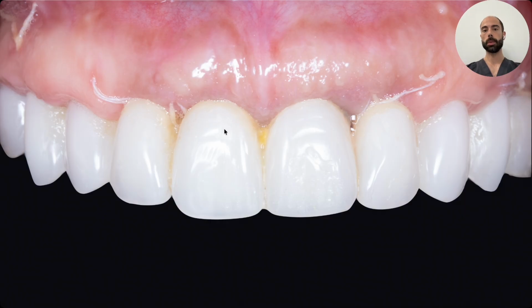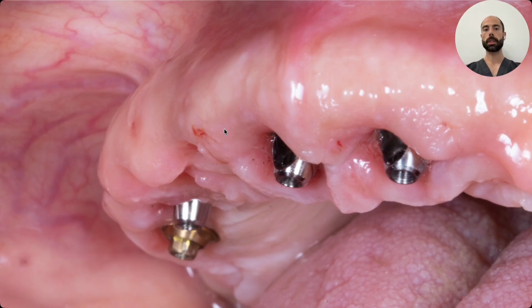And 2 weeks later, this is what we see. Healthy gingiva, perfectly adapted to the provisional, volume exactly where we planned it. Look at that volume that we've added with the full-arch CTG. Every interproximal space has tissue, every site we grafted has responded. And this is the window that matters. The provisional is now the scaffold for soft tissue maturation. Over the next 3 to 6 months, this tissue will mature, keratinize, and the subcritical zone will be gradually modified, adding contour incrementally until the tissue tells us we're ready for the final impression.